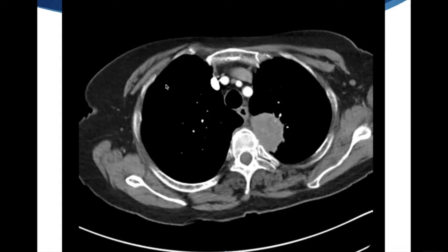We can also use the linear EBUS scope in the esophagus and perform EUS for thoracic lesions — this is a great technique. Here's a lung mass which is a difficult area to access, but you can see it's in direct contact with just a little bit of soft tissue between it and the esophagus. By putting the linear EBUS scope in the esophagus you'll be able to see that lesion and very safely needle it straight through the esophagus.